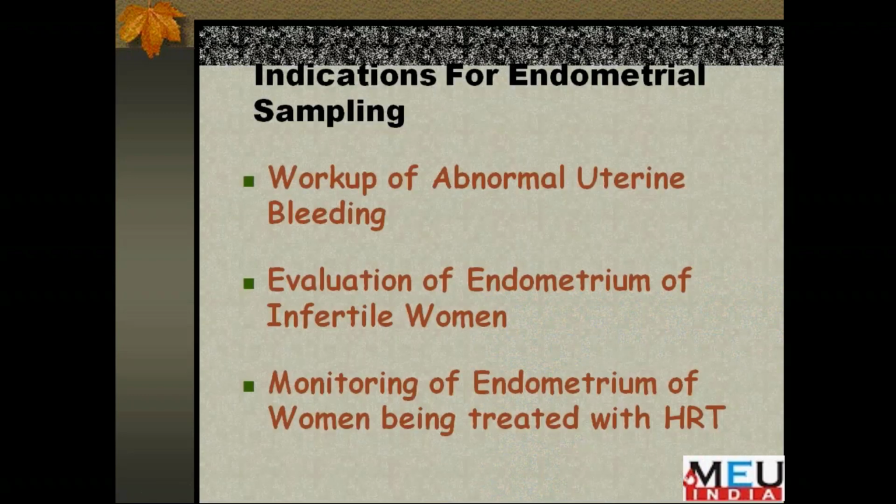Why do we do it? Endometrial biopsy is one of the most common investigations which comes to a pathology lab which has a histopathology setup, and wherever there is a gynecology department feeding the pathologist, there are numerous endometrial biopsies, in which dating is an important component, especially in the evaluation of the infertile woman.